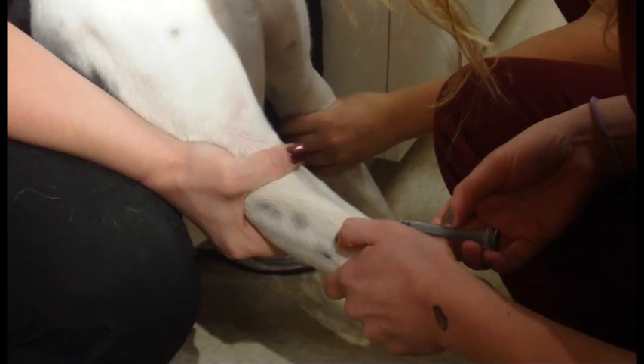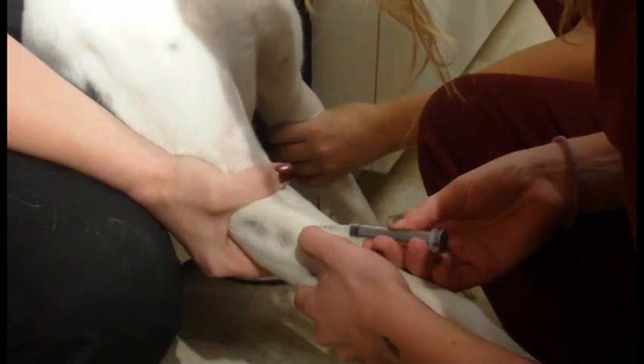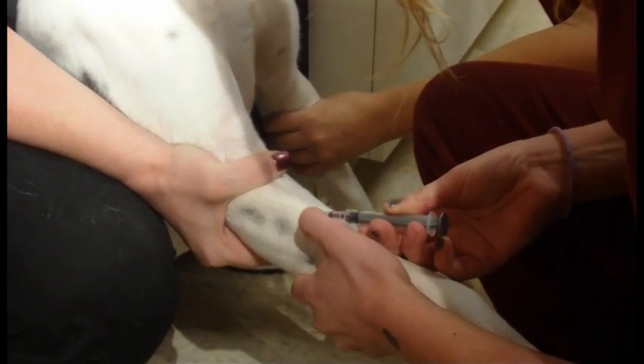Come up higher. Higher. There. Inserting. And then she's withdrawing her blood.